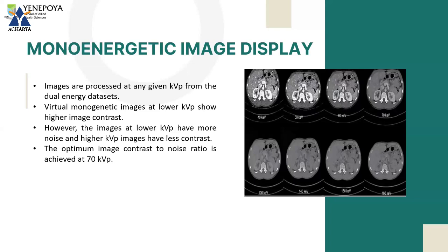Yeah. In CT, everything is based on the contrast which is there in the objects, right? You will see a normal anatomy, and if there is an object which has slightly higher contrast than the compared one, you typically find out the HU value of that. For example, there is a liver. Everywhere in the liver, the Hounsfield unit will be almost similar.